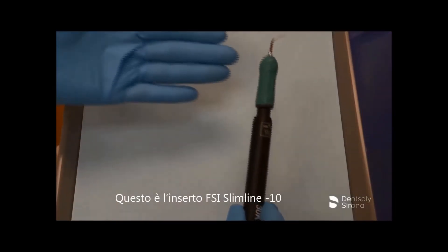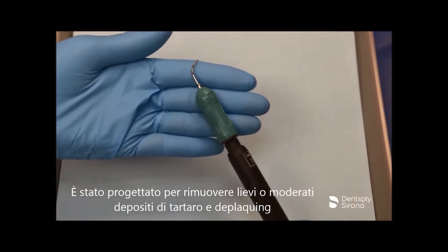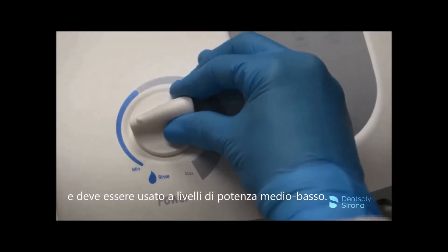This is the Cavitron FSI Slimline 10. It is designed for removal of light to moderate calculus and deplaquing and should be used at low to medium power levels.